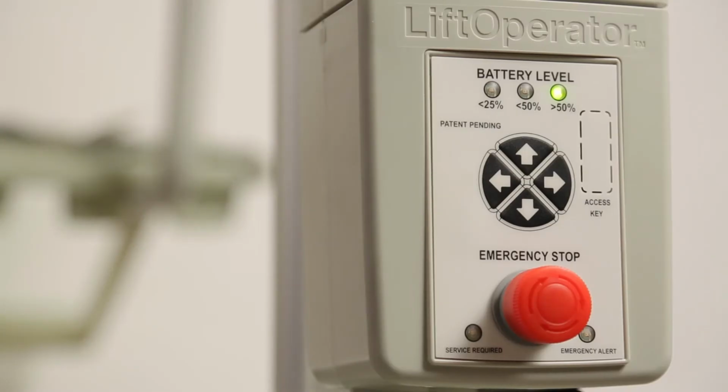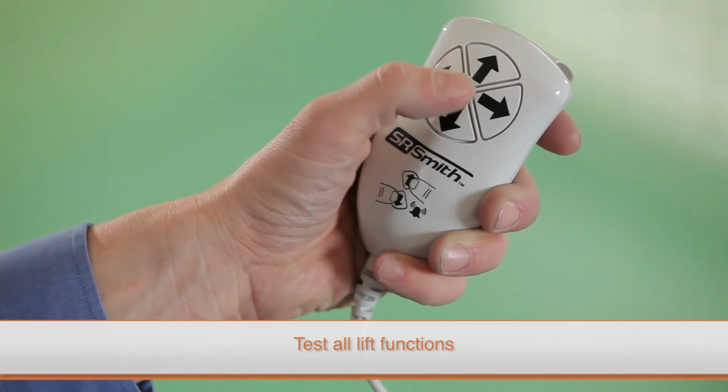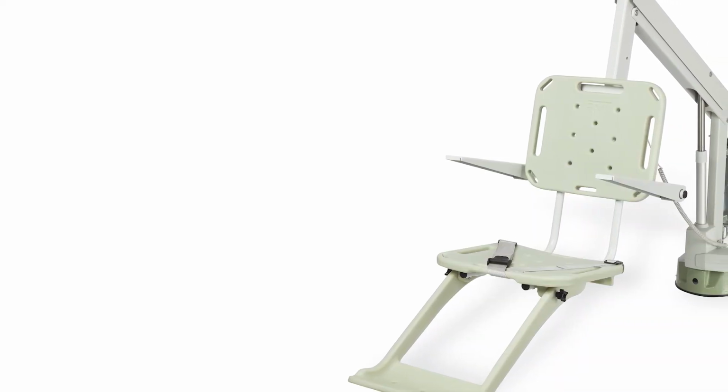Make sure to test the lift functions after replacing either the motor assembly, motor cable, or gears. Use both the touchpad control and the hand control to confirm the lift is functioning properly after installing any new parts.